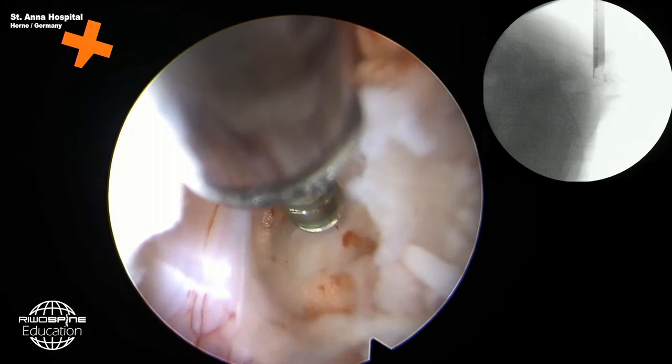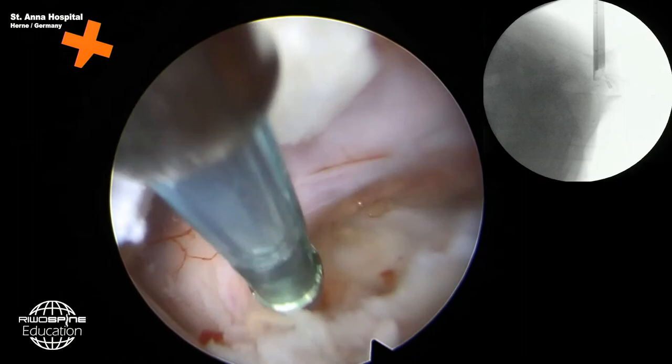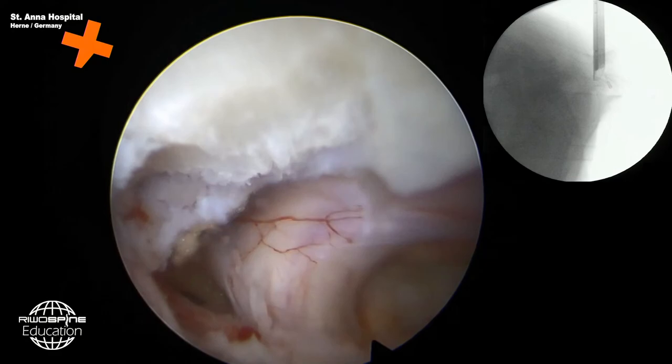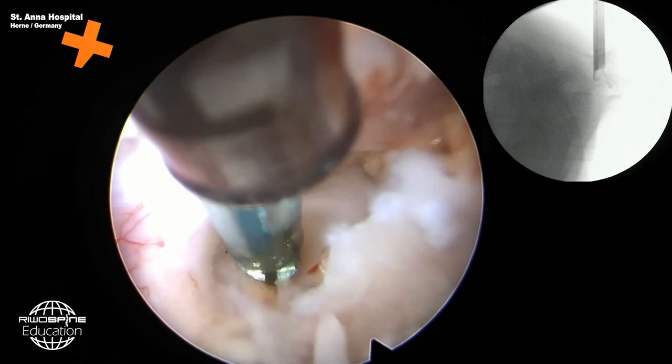Okay, now we have to find the herniation from the anatomy. Right side is cranial. Here starts the C6 nerve. Here's the C7 nerve. Shoulder area, axilla area. Here's the foramen. And now we have to look for the herniated material, which we don't expect to be too fresh. Small rongeur, please.